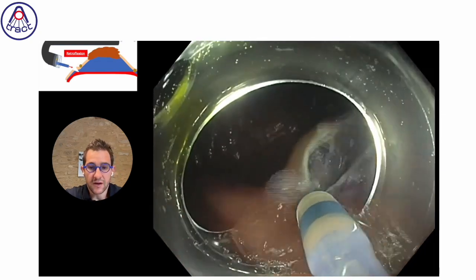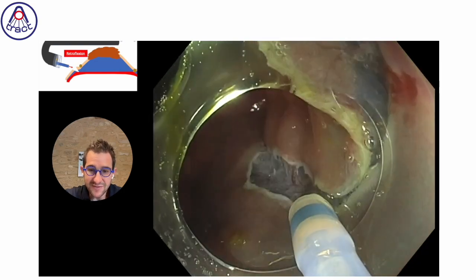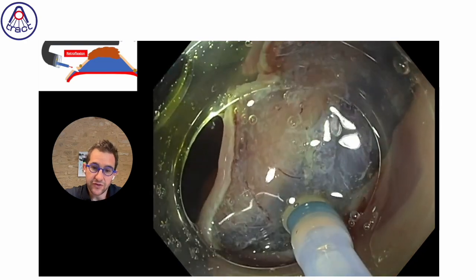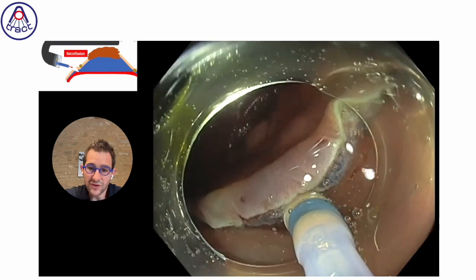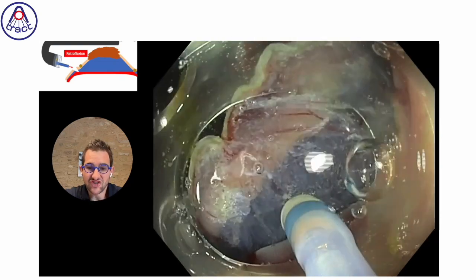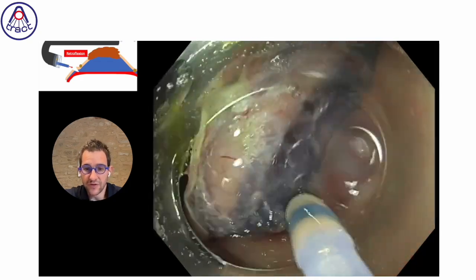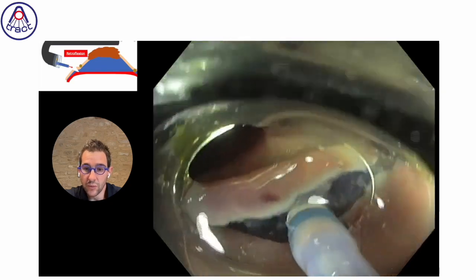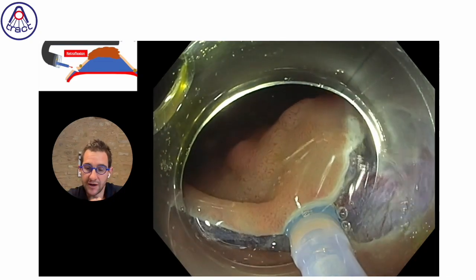If you want to put the traction very early, sometimes you will lose time because it's more difficult to set up, and sometimes also because you will do a wrong setup by catching something you don't want to catch. I mean the muscle or the opposite edge of your incision, the one you don't want to remove, which is the surrounding area of the lesion.